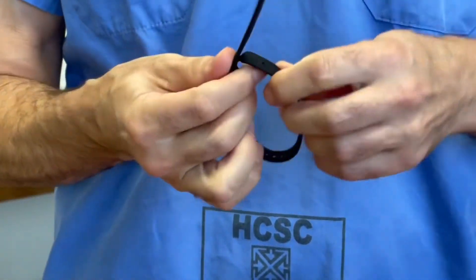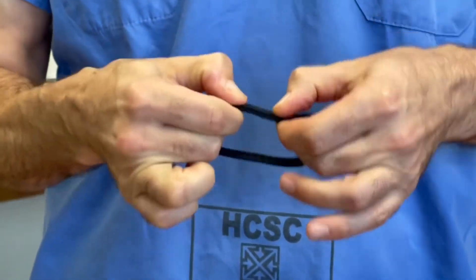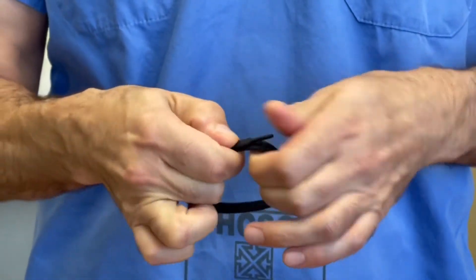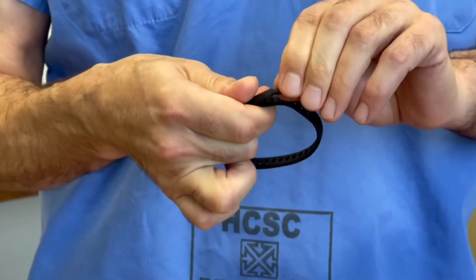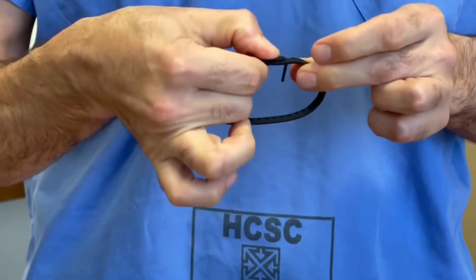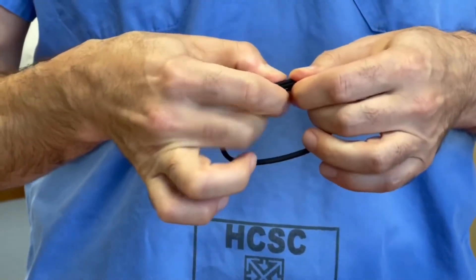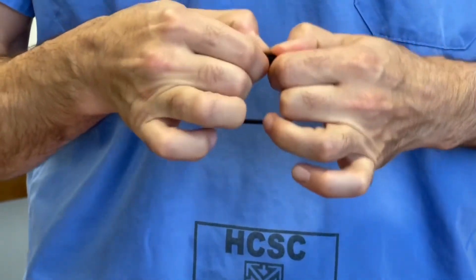The outer tab is then brought across. You make your rigid zone here which is going to support the finger, and then you simply bend the tab 90 degrees. You drop it in the appropriate perforation and that just locks down flush. That does not need the belt loop configuration.